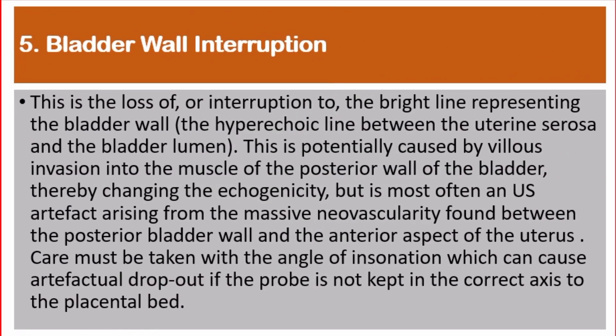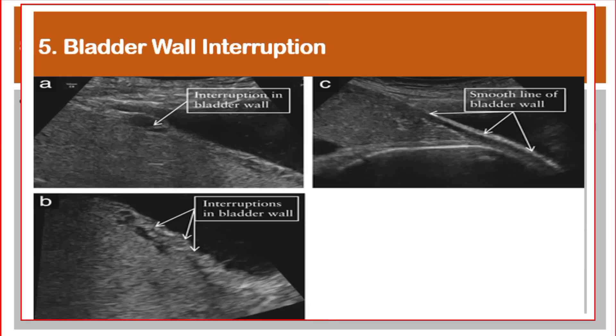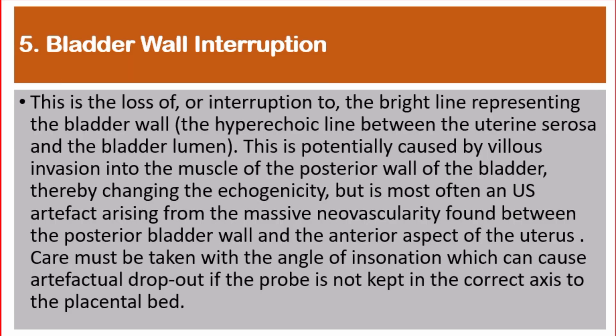Number 5: Bladder wall interruption. This is the loss of or interruption to the bright line representing the bladder wall — the hyperechoic line between the uterine serosa and the bladder lumen. This is potentially caused by villous invasion into the muscle of the posterior wall of the bladder, but is most often an ultrasound artifact arising from the neovascularity found between the posterior wall of the bladder and the anterior aspect of the uterus. Care must be taken with the angle of insonation, which can cause artifactual dropout if the probe is not kept in the correct axis to the placental bed.